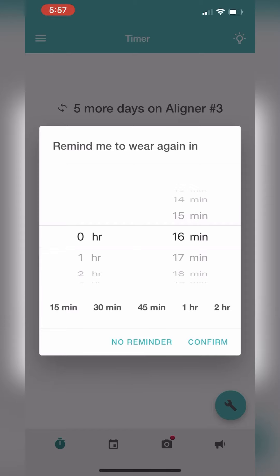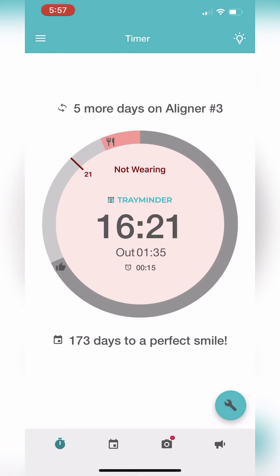Once you have selected your time, hit confirm and the circle turns red. Remember that red means that you're not wearing your trays. Once you put your trays back on, hit the circle again and it will turn teal.